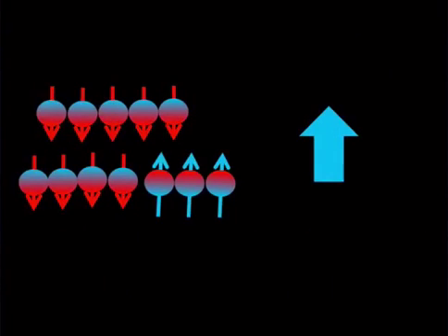So the first result, or consequence, is that the net magnetization vector moves out of alignment with B0. This occurs because some of the low energy nuclei are given enough energy to join the high energy population, high energy being the ones that are directed in opposition to the magnetic field. As the vector, or the NMV, reflects the balance between low and high populations, the resonance causes the vector to no longer be parallel with B0, but instead be at some certain angle to it.